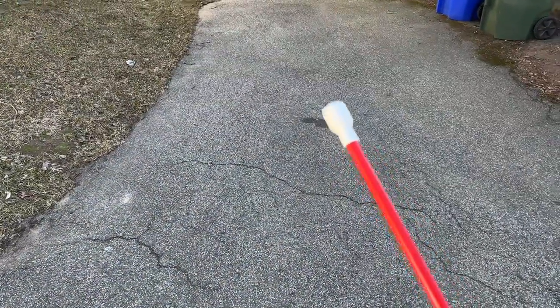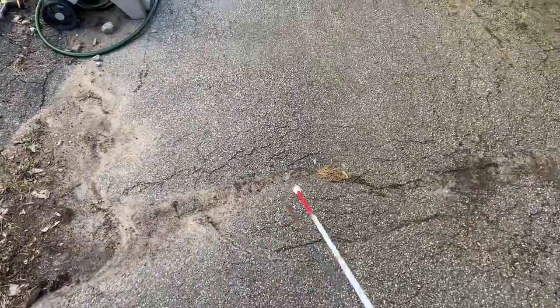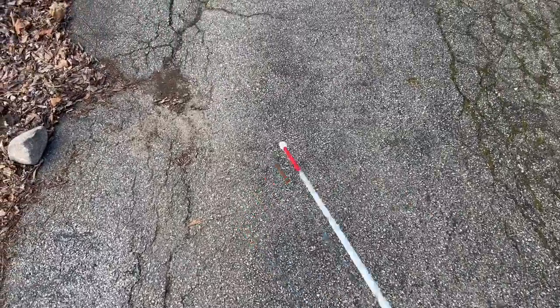For the marshmallow cane tip demonstration, I have it attached to my long white cane on the same asphalt driveway. This cane tip is very similar to the pencil tip in that it's designed primarily for two-point touch. One benefit over the pencil tip is it's a little more rounded, so it tends to get stuck a little bit less, but it still gets stuck quite a bit. For a two-point touch traveler, the marshmallow tip might be a better option than the pencil tip.